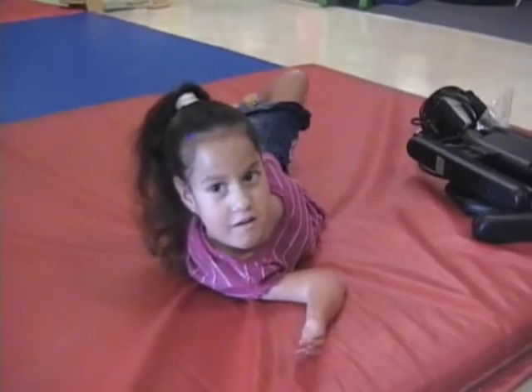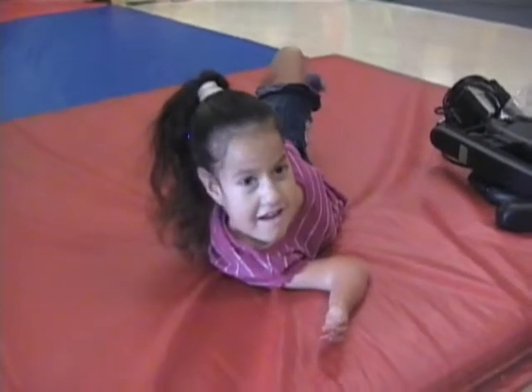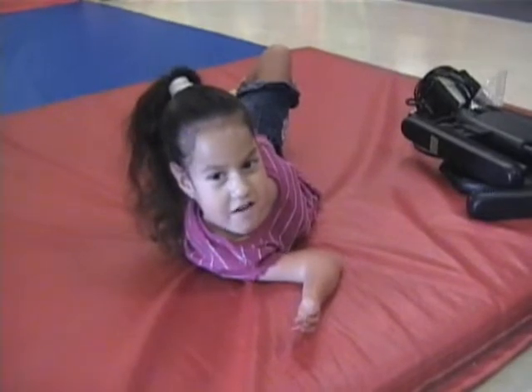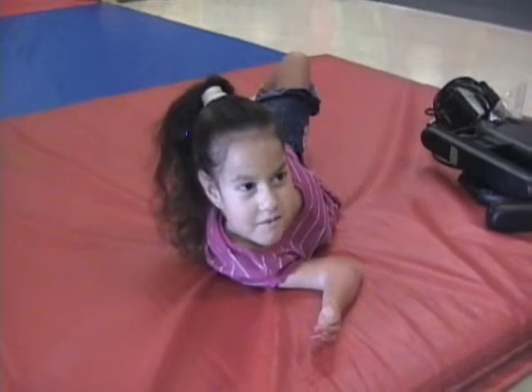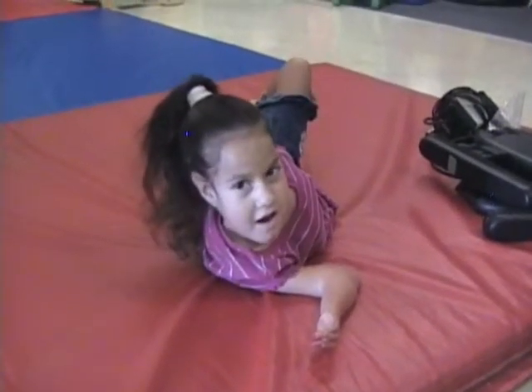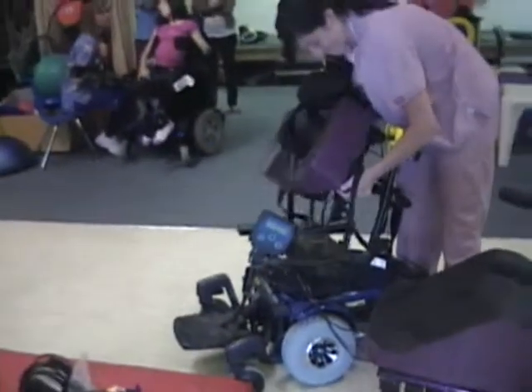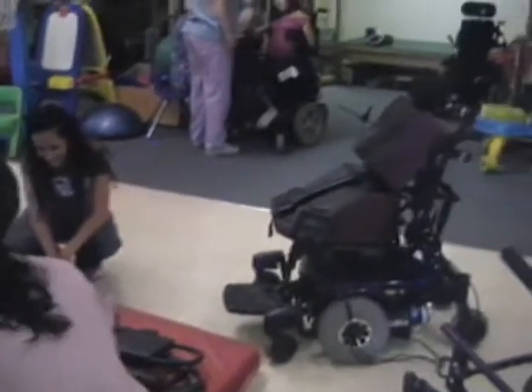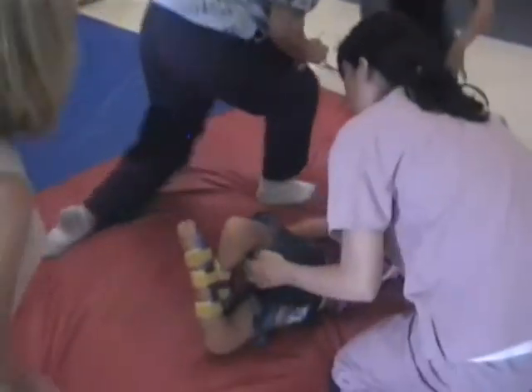Ariana is now talking to one of the other therapists that work here at the school. And by the way, if we have enough time, I'm going to get read whichever book I pick. The therapist is still trying to put the power chair together, and now her chair is put together and she's going to be put in the chair for the power training.